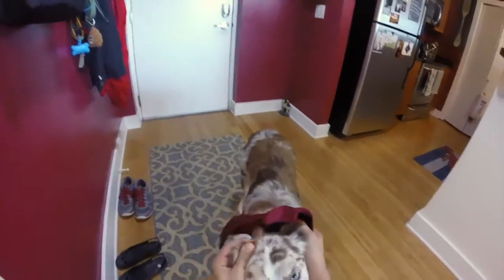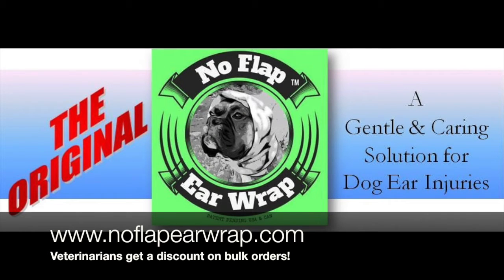After running around and playing for a while, their ears stayed up under the wraps exactly where we left them when we put the wrap on. If you're ready to get one for yourself — or your dog, that is — go to noflapearwrap.com. If you're a veterinarian and your office is ordering a few, check online for a discount. For more product reviews, check us out at dogfriendly.com.